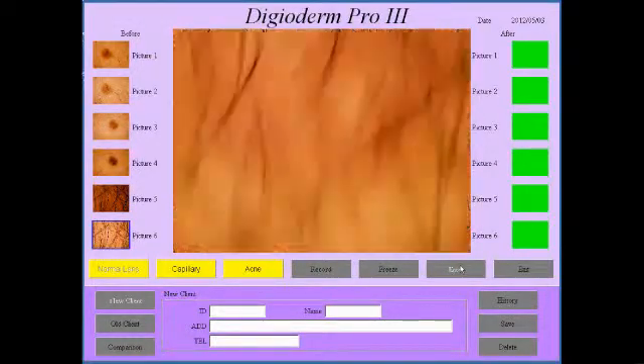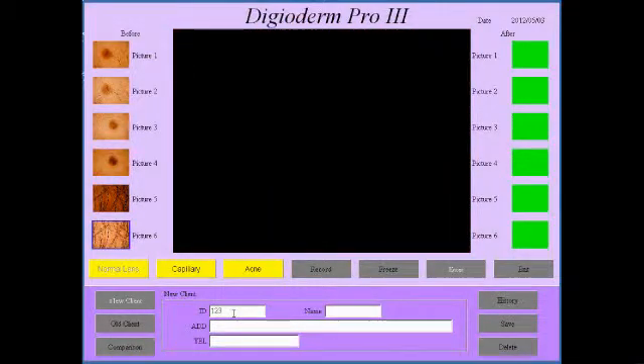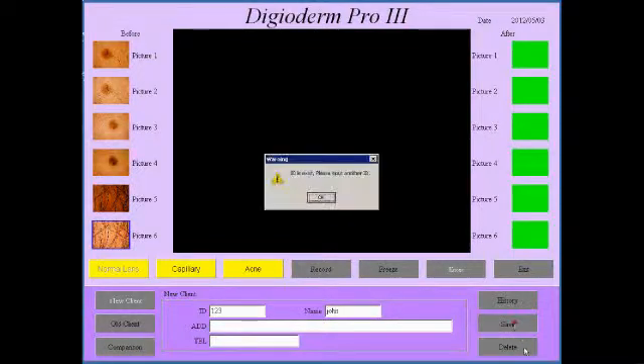And once I've done all that I can then just go and enter in ID 123, put in a name — John — address and file number, and save this.